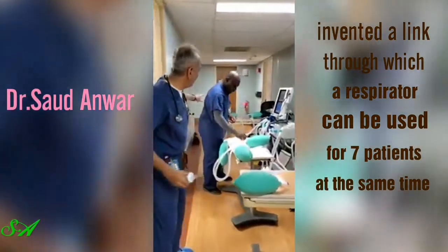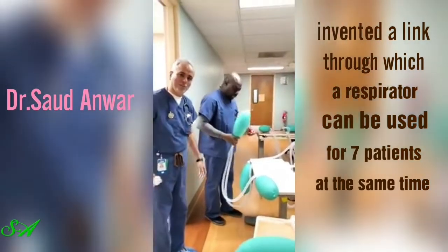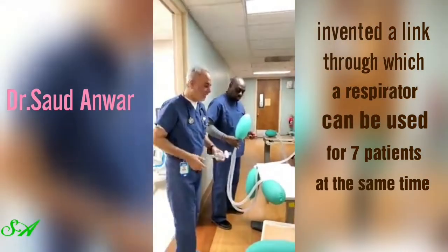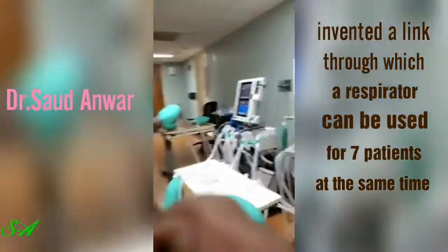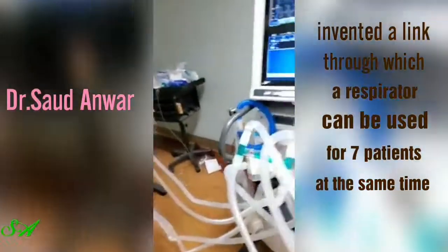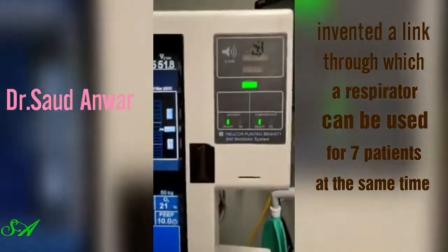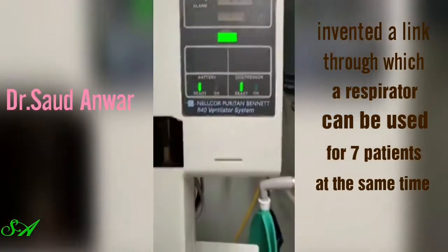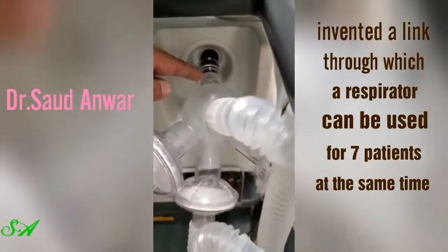Here we have Marvin. Marvin is a respiratory therapist, my star. You've seen him before doing good work. And what we have been able to do is a few things. I'll take this over here and show you some of them. So this is the inhalation part of the ventilator, and the ventilators we are using are the Puritan Bennett 840 ventilator system. And we have that same thing connected on the inhalation part.